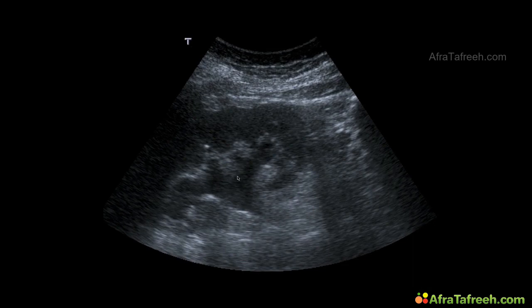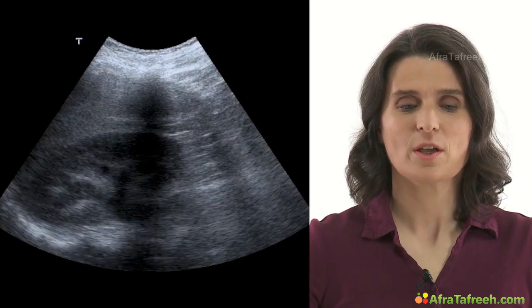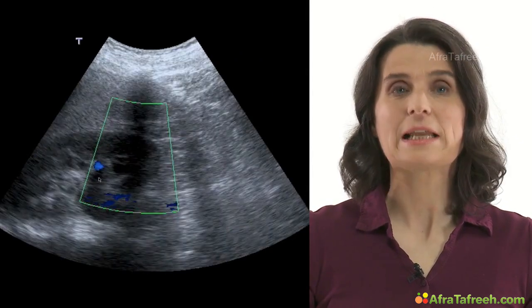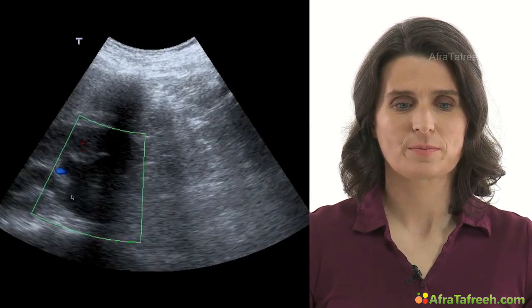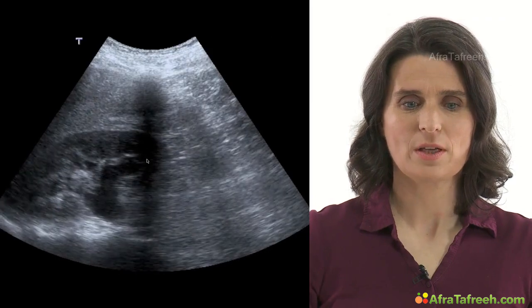Here we got a picture of hydronephrosis, grade 2. You see dilated renal pelvis and also the minor calyces show a dilatation. This is a video clip of hydronephrosis. You can clearly see anechoic, the cause of fluid in the center of the renal pelvis. And also here.